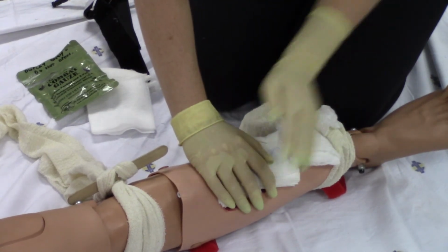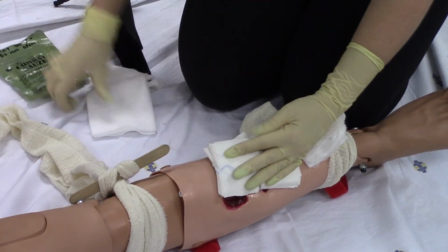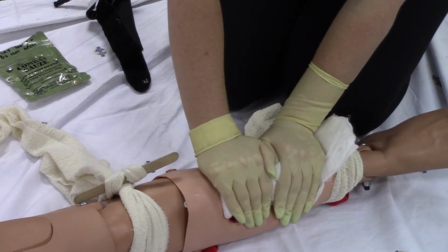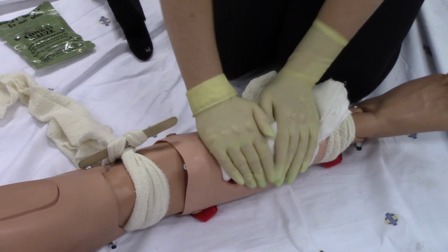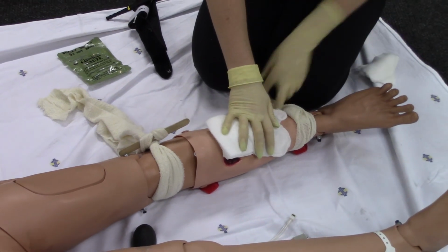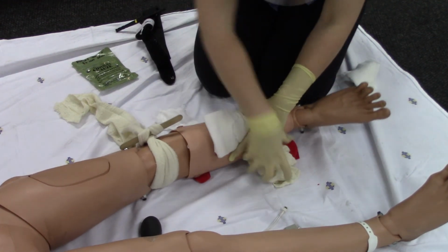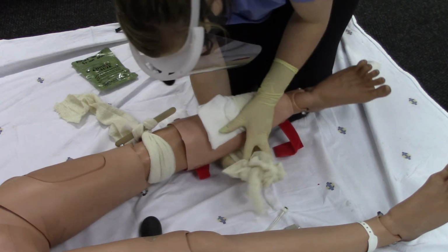Apply pressure with a dressing, either gauze or trauma dressing. Compress the wound at the source of the bleeding for at least 2 minutes. Evaluate for cessation of bleeding. If the bleeding has stopped, dress the wound appropriately. However, if the bleeding continues, reapply hemostatic agent and ensure direct pressure is applied with the dressing over the source of bleeding.